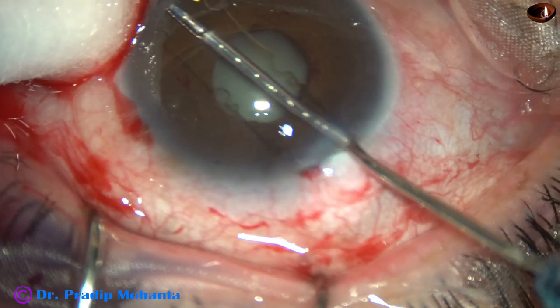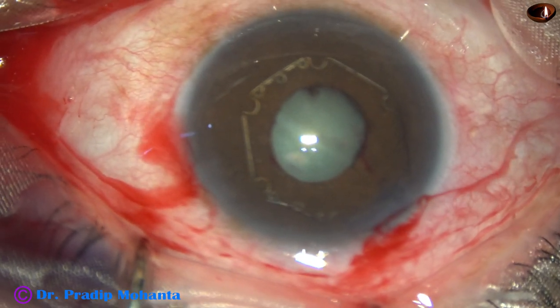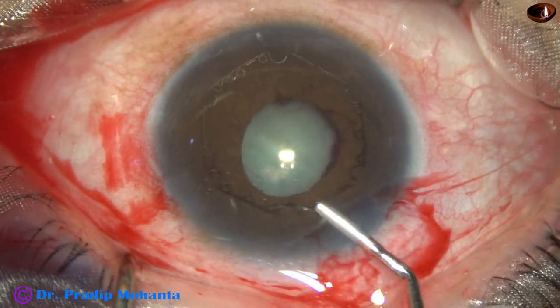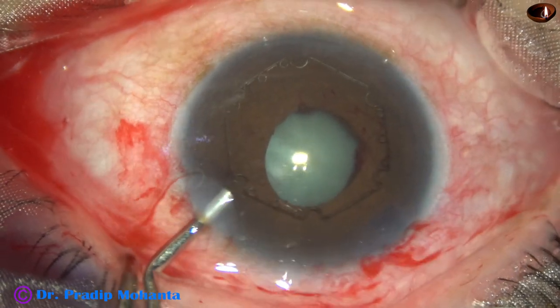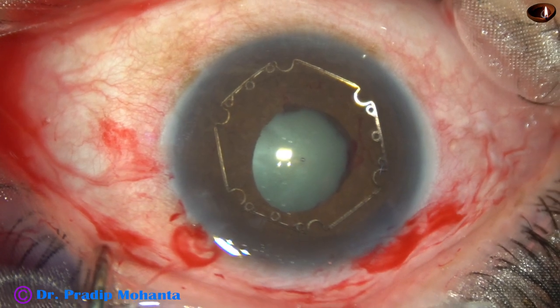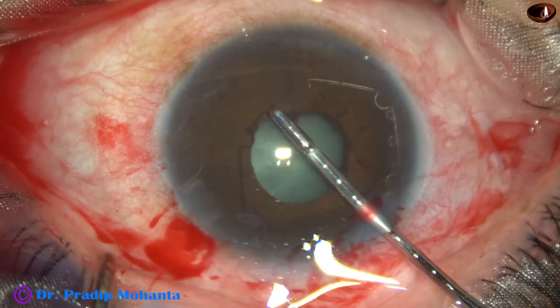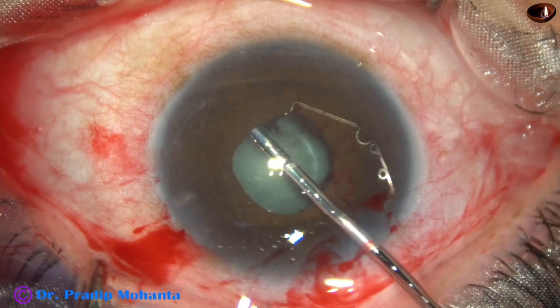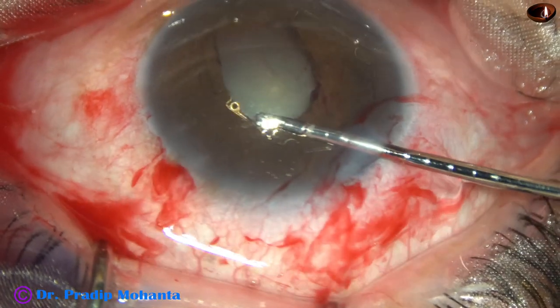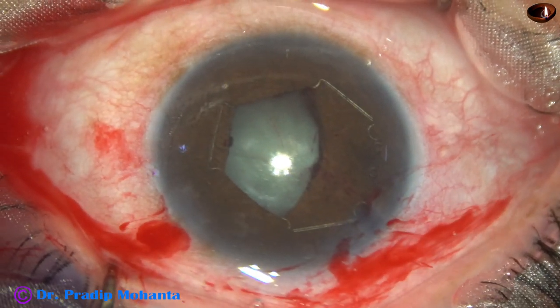Now see what happens — the trailing end is stuck in the main incision. When this happens we cannot tuck the leading end in one go; we have to place the PHX completely in the anterior chamber, inject visco, and then try again. Hold the middle tab again and tuck the leading flange under the iris.